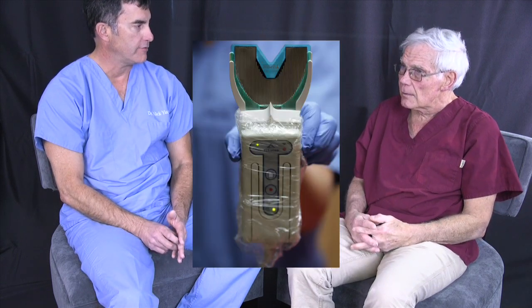The multiple portions of the methodology which is involved. Right. The face bow recordings. Also, there are no lateral, or not really accurate for the individual, no lateral recording medium to determine the translation, the sideways movements of the mandible. Right. And the T-Scan sensor, in your mind, that's invaluable, yes?